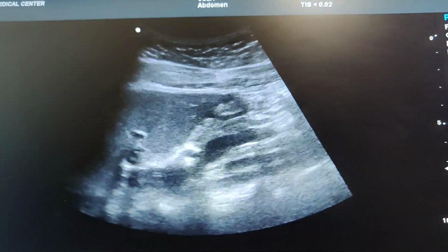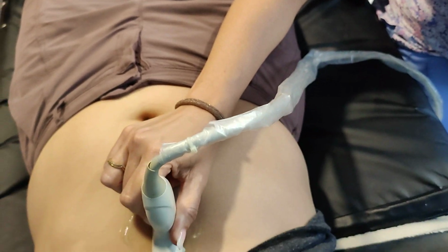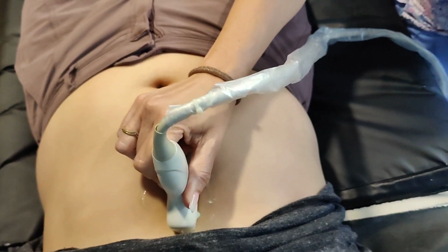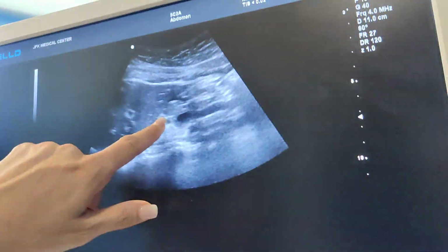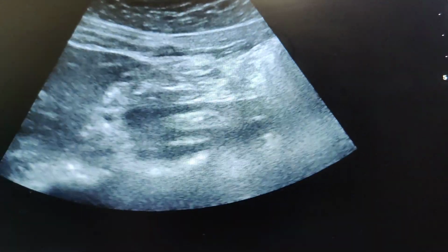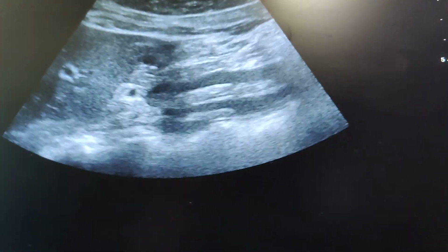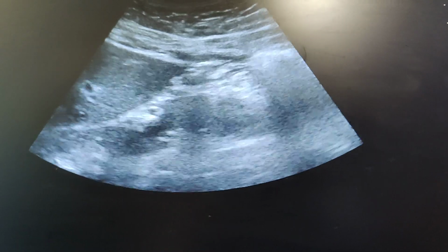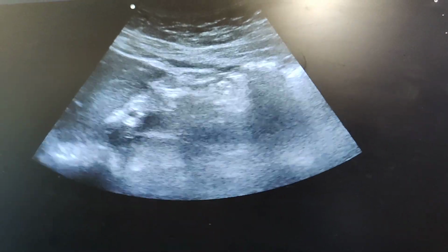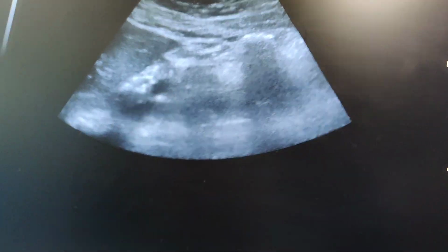So this is sagittal. I just turned the probe in a sagittal or long position. And that helps me evaluate the head of the pancreas. Let's increase this a little bit more. And then I slide down just a little bit and I can see the body of the pancreas. And then the tail.